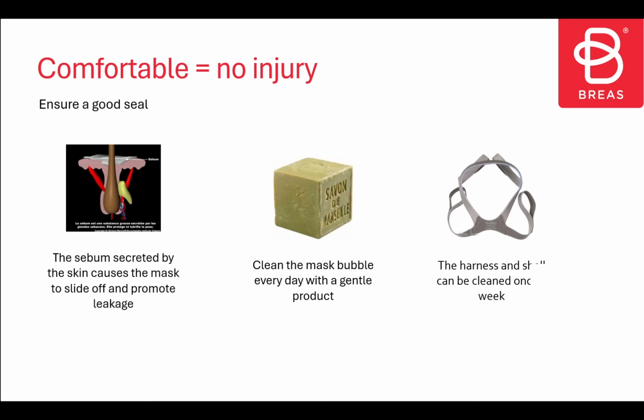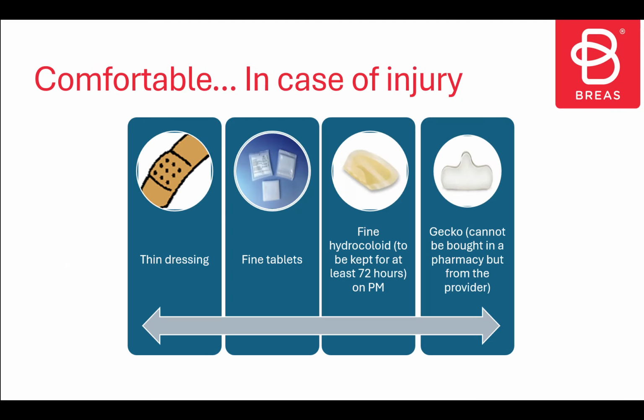A few tips. As a reminder, the sebum secreted by the skin can cause the mask to slip. So it's very important, as much as possible, to cleanse the face well before putting on the mask, but above all not to put on cream. It is important to clean the mask bubble every day, that is the entire part that is in contact with the patient's face. It should be washed every day. And the headgear and shell, which are not in direct contact with the patient's face, can be cleaned once a week.